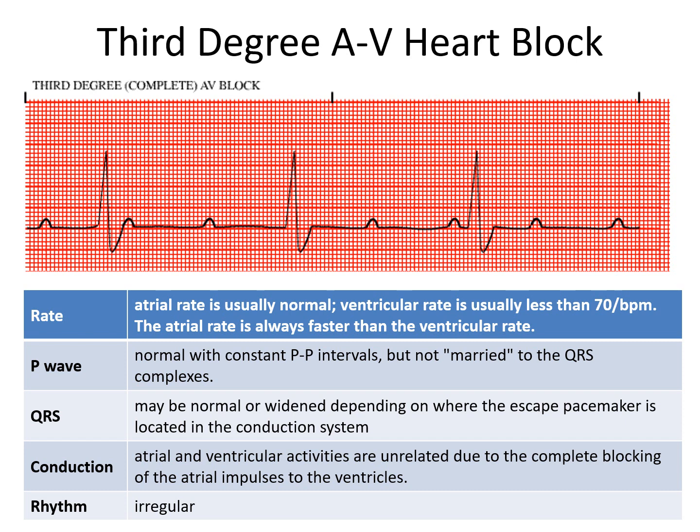But they eventually must get a permanent pacemaker. Okay? A temporary pacemaker means they're in the hospital and waiting. They don't go home with a temporary pacemaker, but it's something that we have available to us in the hospital.